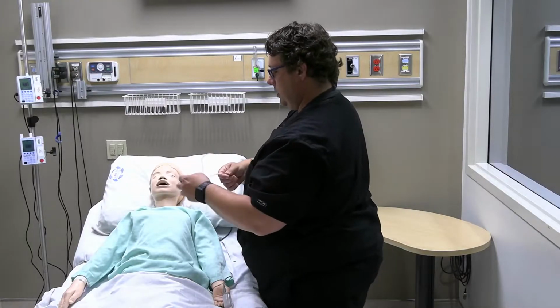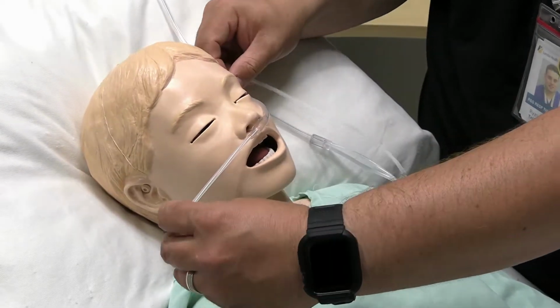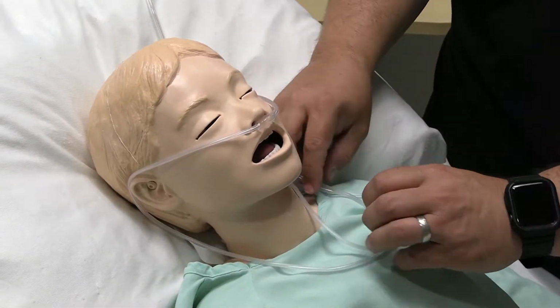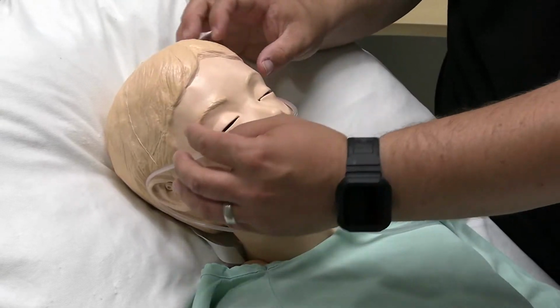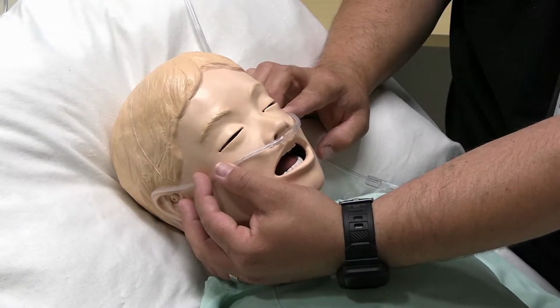What we do want to do, again, is just take your prongs, following the natural curvature, insert into the nares, following around the ears, just like so, and then adjusting for comfort. Another thing that you can do is use a piece of Tegaderm to additionally secure to the cheeks.